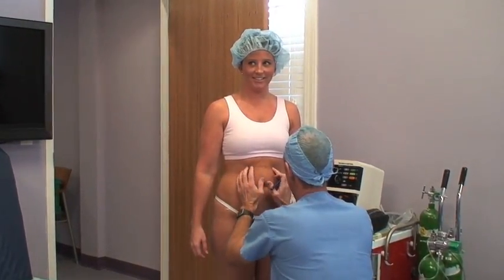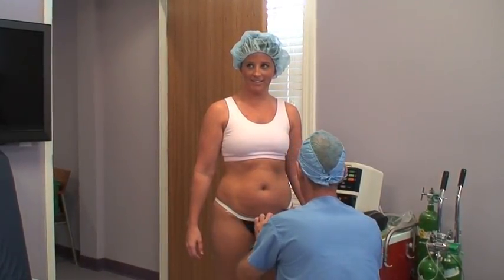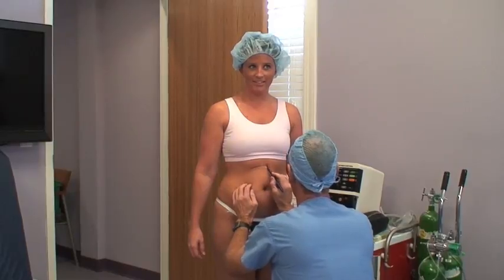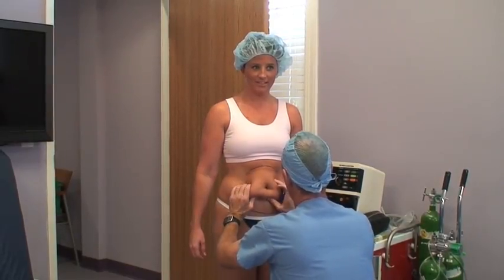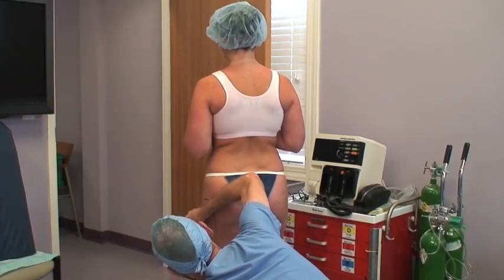We're going to do a couple of areas on Jolie today — her abdomen and her outer thighs. The first thing we do is mark these areas with her standing. Unfortunately, when she lays down, things tend to move around, so this allows us to have a pretty good indication of where we want to work.